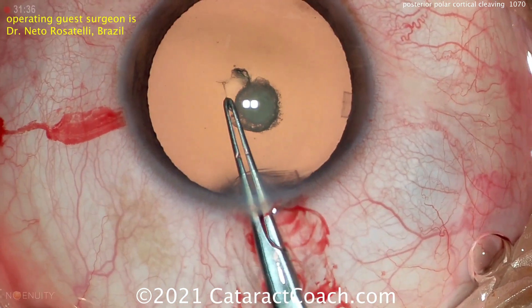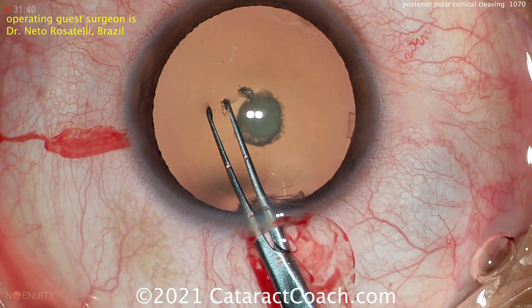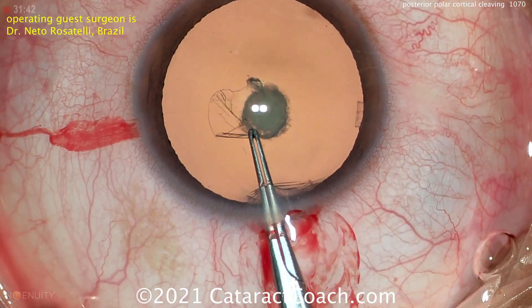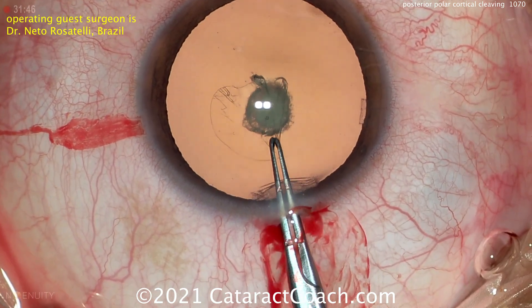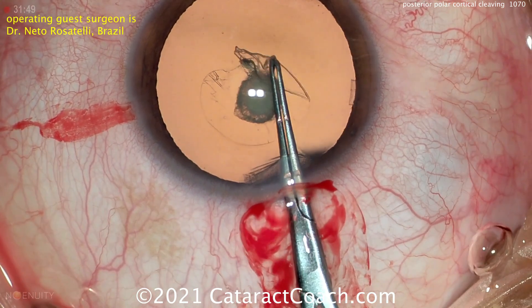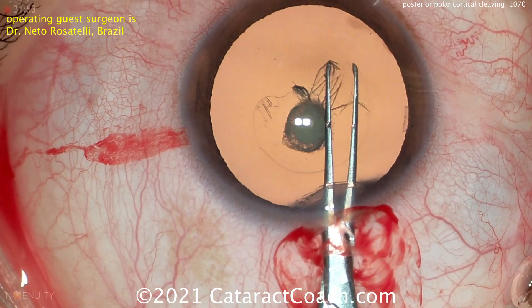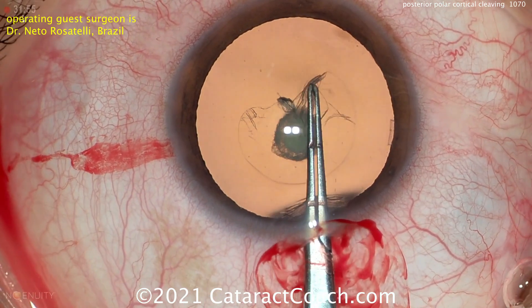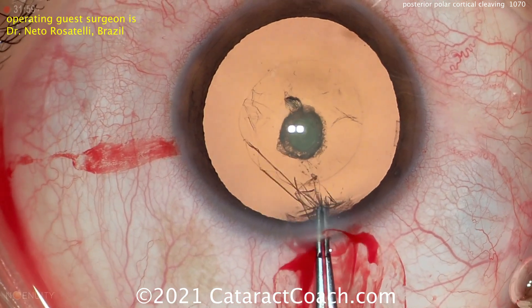So here making the capsulorrhexis, starting off with just the forceps. It's important to get a five millimeter rhexis here, maybe five and a half. The reason is, remember if the posterior capsule breaks, you need to be able to place a sulcus IOL and hopefully with optic capture. But Dr. Rosatelli has a way of doing this while minimizing the risk of rupture.